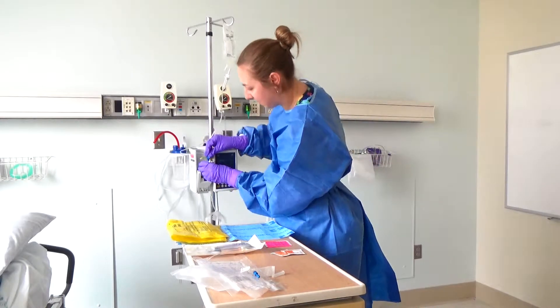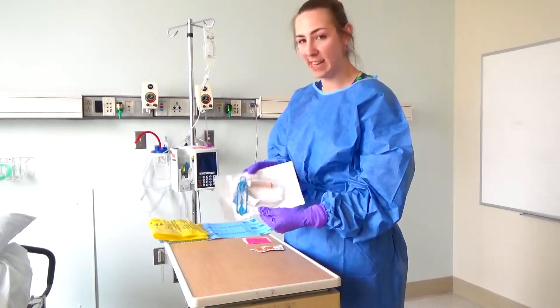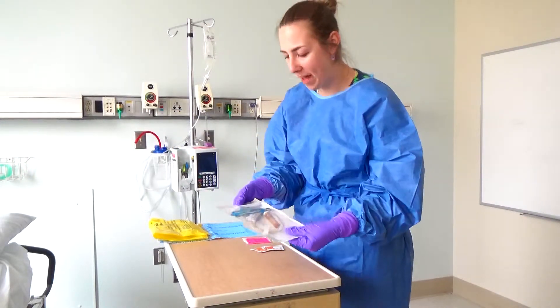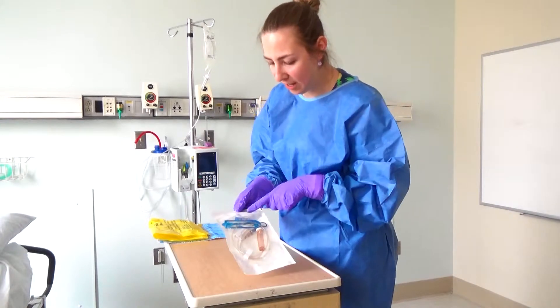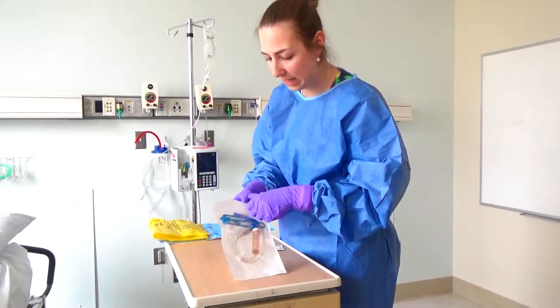I'll insert the cassette into the pump. The second thing I'm going to do is take my special chemotherapy secondary tubing and open the package. I'm going to take special care to keep my access points clean and sterile.